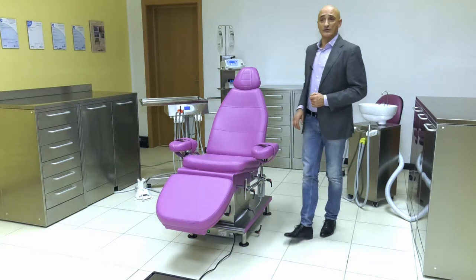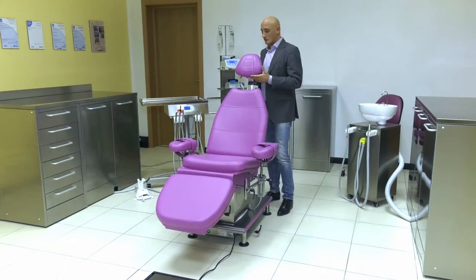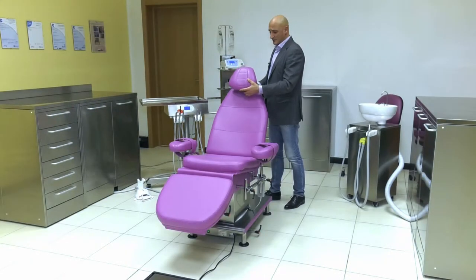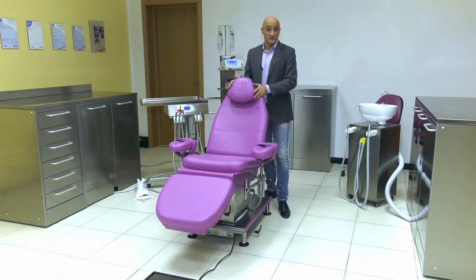Clearly, the headrest is also adjustable and can be lifted by up to 15cm. This knob allows rotating the headrest forward, ideal for people who are shorter, and very useful for children.